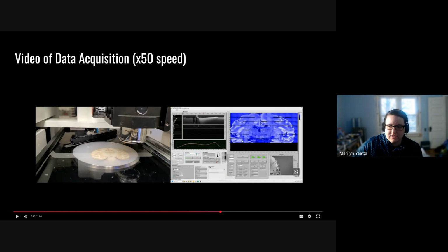To the right, this is my real-time en-face. This is basically a big matrix where I'm dumping all of my en-face images in. When I say en-face, I take the average in depth. So I'll basically say, go from about pixel 50 to about 150, from here to here. Just average those to give me an idea of what my signal looks like, and that outputs this.